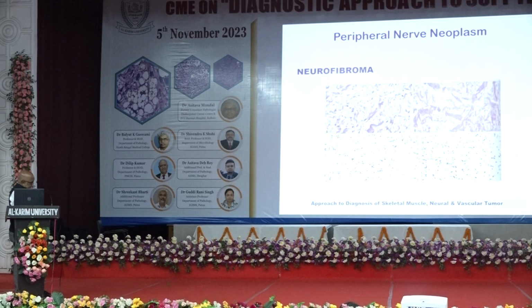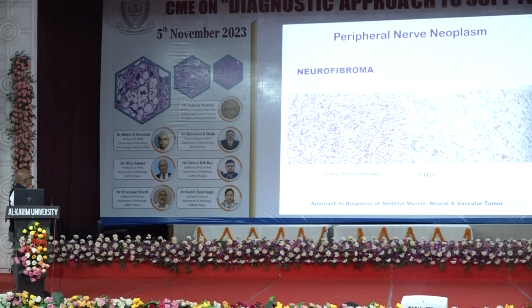See this microscopic picture, these wavy nuclei. And this is the fibrocollagenous stroma. Here you can also see, this is the S100 positivity. This is a cellular neurofibroma. It is CD34 positive, showing these processes.